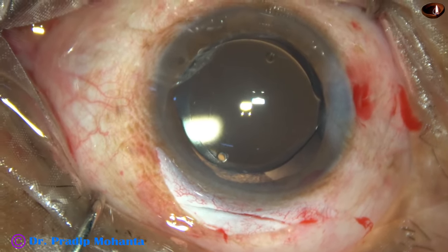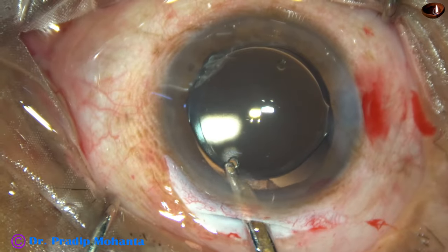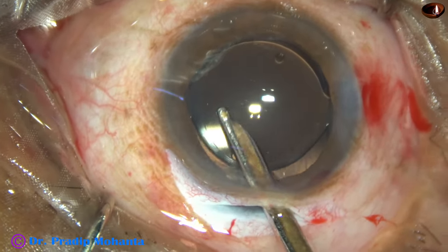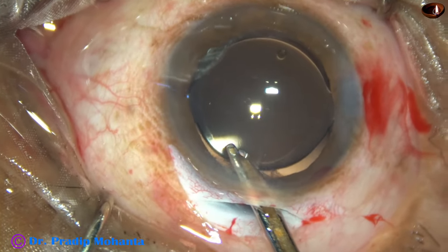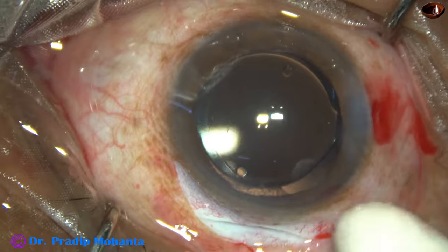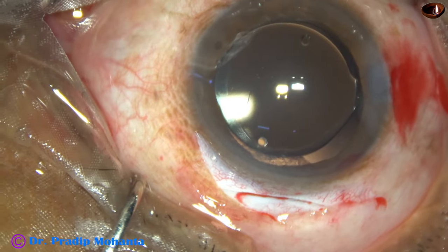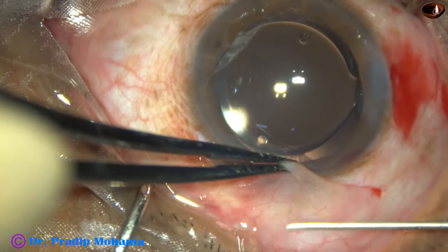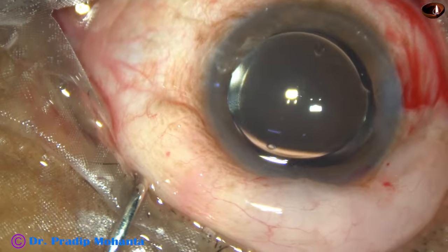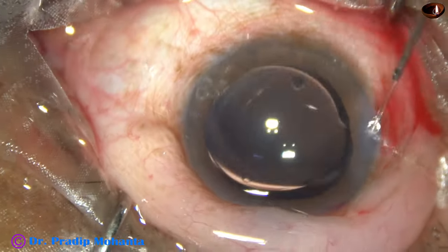The side port is hydrated and it gets closed. The main wound has a nice valve and will not require any suture in this case. Forming the anterior chamber nicely — the anterior chamber is nicely formed. There is no leakage from the main wound. Now, to oppose the conjunctiva to the limbus: in this case I am not using any suture. I am just injecting gentamicin and dexamethasone subconjunctivally. Between the conjunctiva and Tenon's it swells up and the conjunctiva gets opposed to the limbus. The superior rectus bridal suture is removed and the case is concluded.